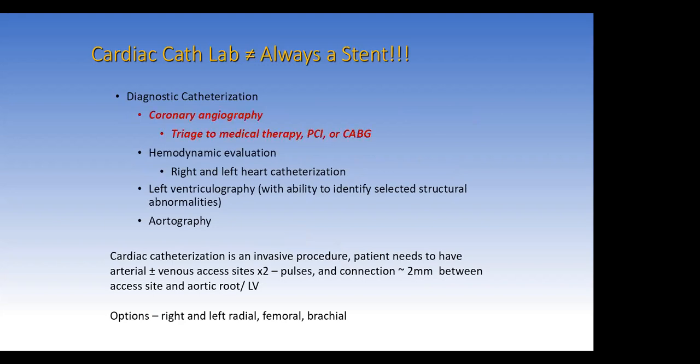This talk will focus on coronary disease and coronary angiogram, which so far is the best way to triage patients between going for medical therapy, doing the PCI, or going forward for bypass surgery based on their anatomy.